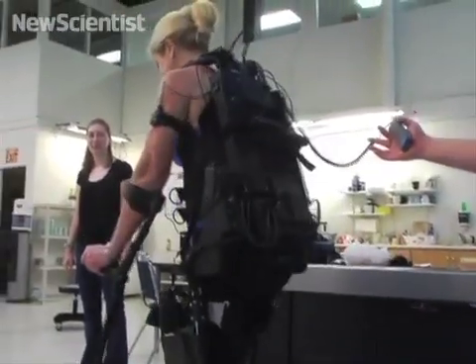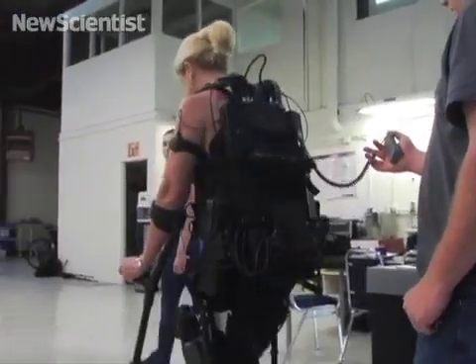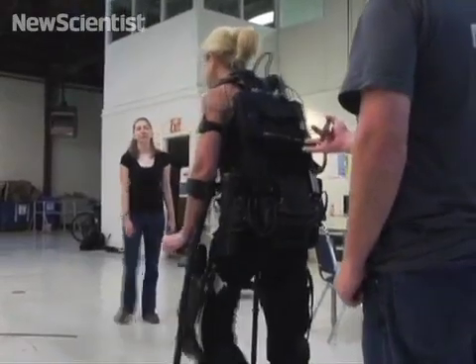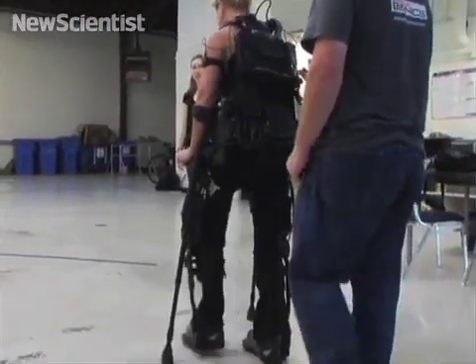Eventually, exoskeletons like this could expand the range of activities available to people with spinal cord injuries. They have tools available to go skiing or even motorcycling — so why aren't there tools to help them walk as well? You're not going to replace the wheelchair, but at least you should have that tool in your bag.